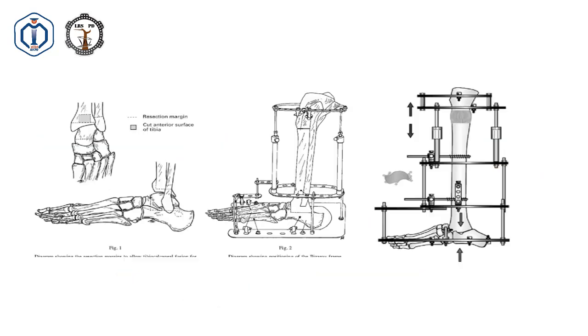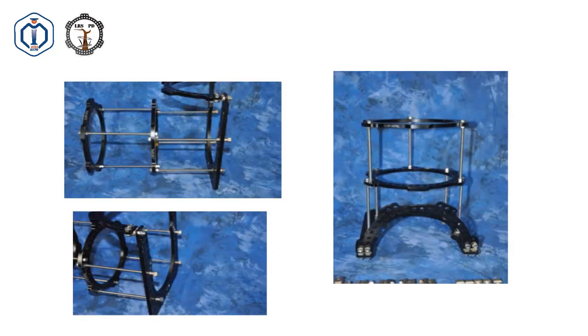retrograde fibula. And again, this is the frame for compression arthrodesis with restoration of the length by proximal tibial osteotomy. A simple frame, just foot ring and 2 rings, but if you need to lengthen, you have to add 1 ring more for proximal tibial osteotomy.